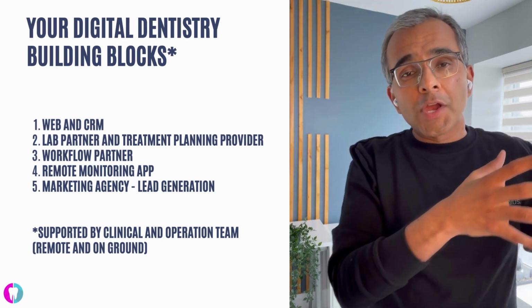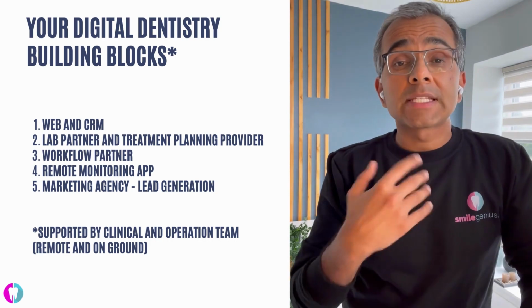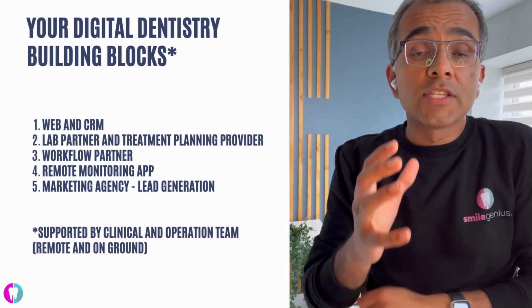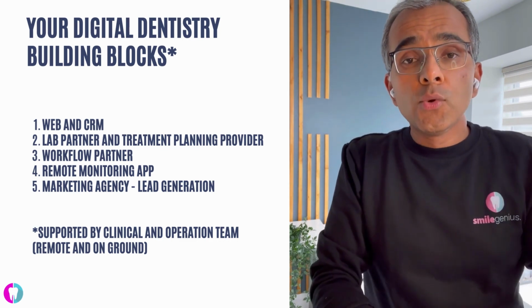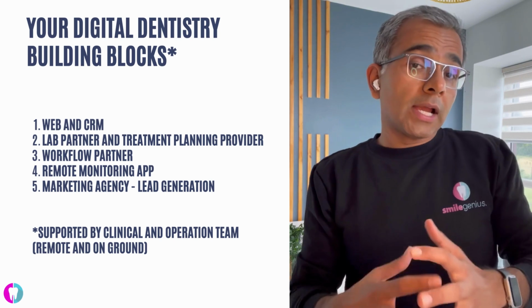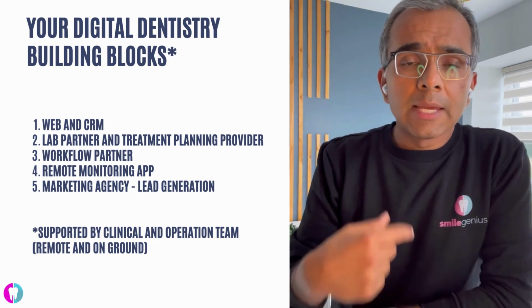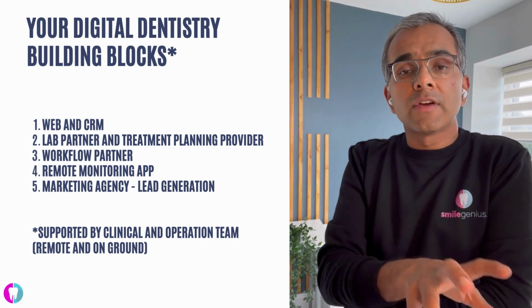After that, you enter into the world of workflows, where the clinical workflows and the clinical aspects come in. When you enter that, the third thing you need to do is identify who is your lab manufacturer. And when I say lab manufacturer, are you manufacturing it yourself? Are you doing in-house manufacturing, buying the printers, or are you looking at a third-party manufacturer who can white label the products and the aligners for you? Identifying that is very important.